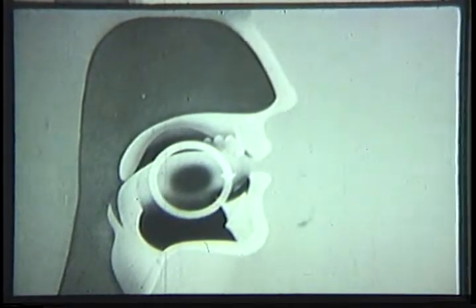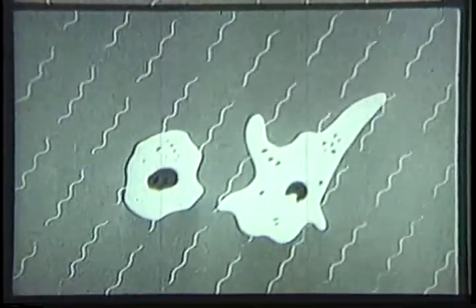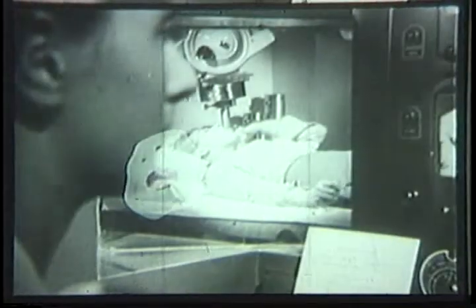Because Mrs. Gordon's tongue has a growth of malignant tissue, high-voltage X-rays are being prescribed to achieve the desired therapeutic effect. These high-dosage X-rays have a lethal effect upon cells which gradually destroys them. However, normal cells are not killed as rapidly as the malignant cancer cells. X-rays, therefore, can be used to destroy cancer cells without permanently damaging surrounding normal cells, which can recover from the effects of the radiation. As soon as the technician has started the exposure, she observes her patient to make sure she's all right.